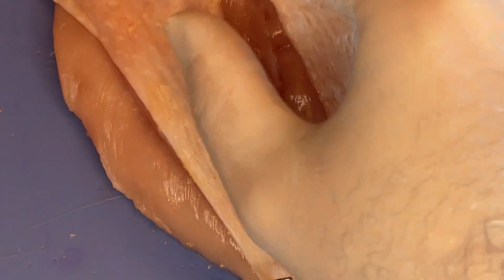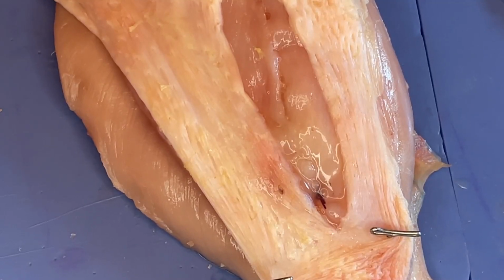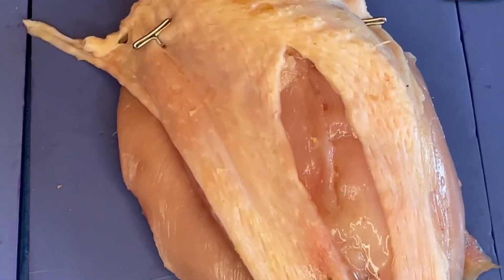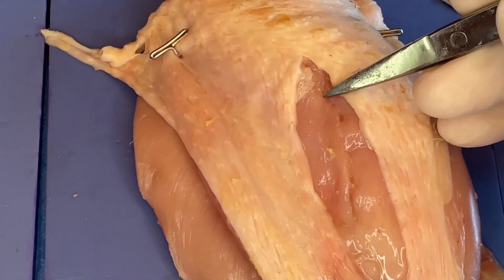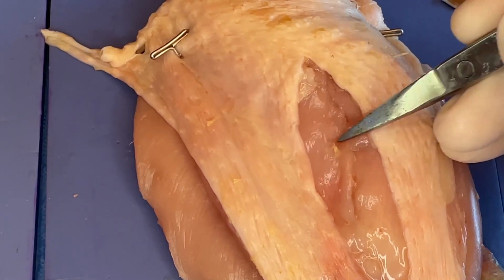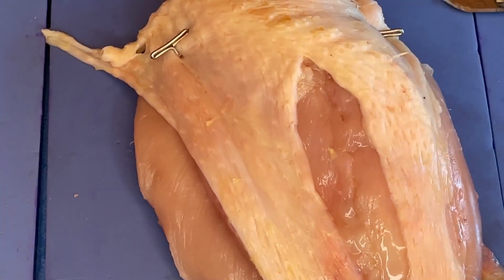So subcuticular closure, again, with our skin here not really being connected, doesn't really do justice to that, but you can see here when we're just under the edge of the tissue how it brings those edges together nicely with a buried suture.